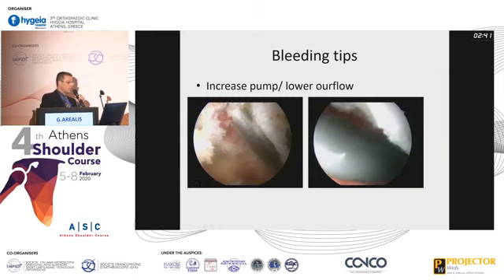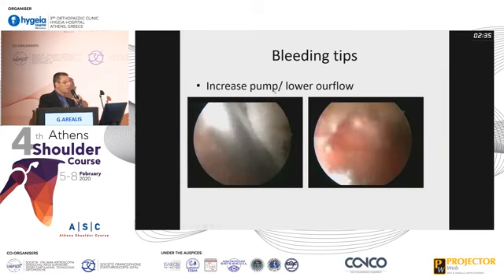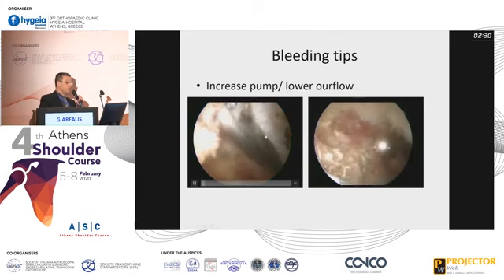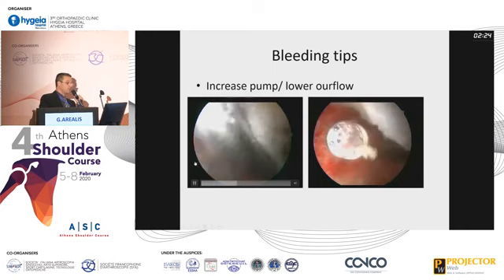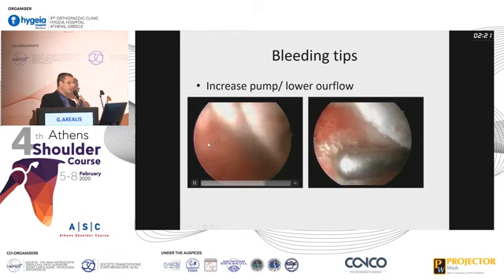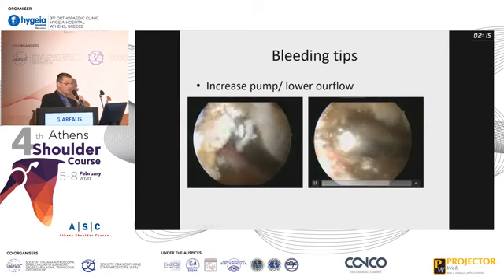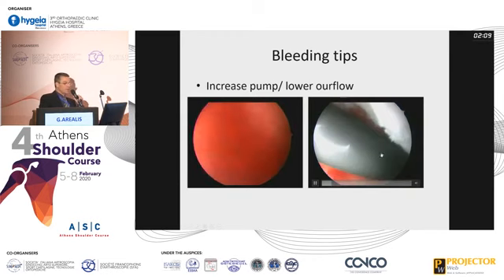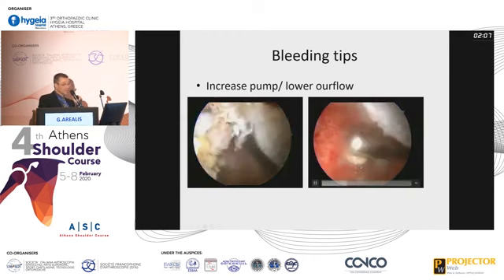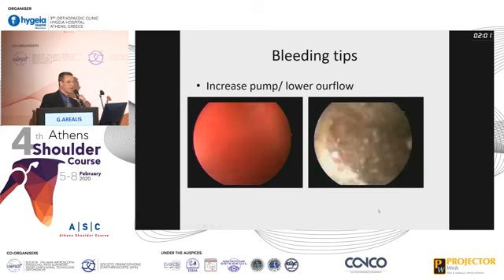There are two bleeding tips. So when you do this, you may get bleeding, especially if the pump pressure is low. So you always need to increase your pump pressure and reduce the outflow of your shaver. But if you do get bleeding like on the left, it's always coming from the bottom left corner on this. So if you use your wand, you can go blindly and ablate at that corner, and it usually stops all the bleeding. If you get bleeding from the actual bone, then again, you can use the wand in the cutting mode, the yellow button, and again, you can stop the bleeding coming through the bone. This sometimes happens when the blocker is not fully working or if the anesthetist is outside of theaters.